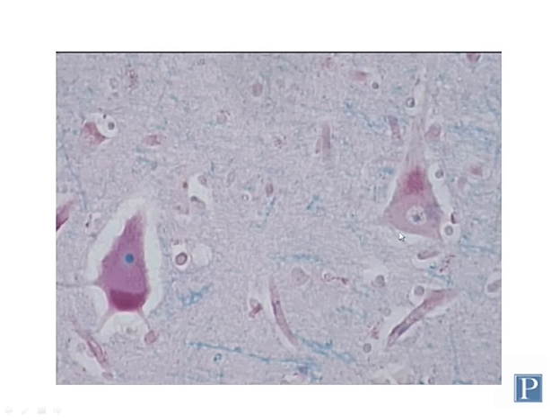These pyramidal cells also have axons, which you may or may not be able to see. And you do not need to be able to distinguish between axons and dendrites, except when neurons are stained with Nissl stain. And that's the only case when you can really distinguish them histologically. So we'll see what that looks like in a few slides.